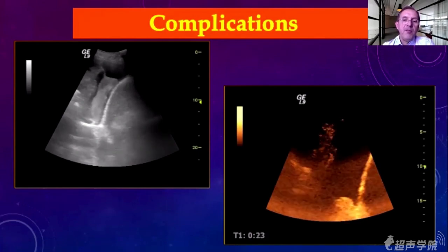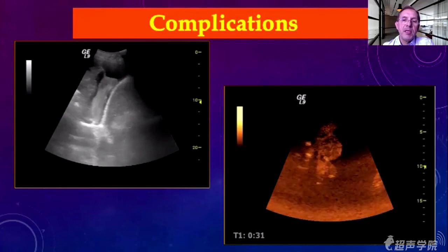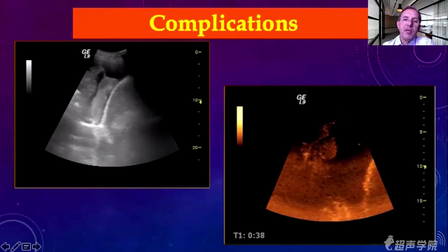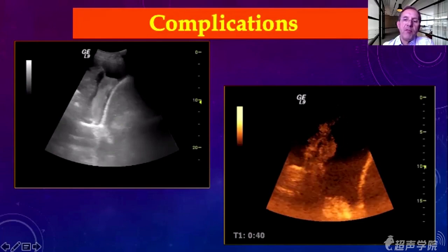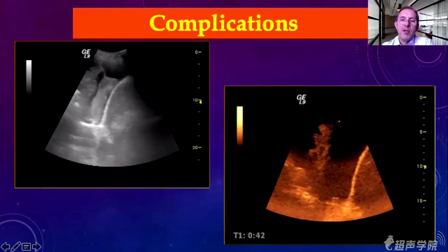And in fact, we saw that there is actually no bleeding inside. The bleeding has stopped. You see very few bubbles here, probably some drops of blood, but it was not an important bleeding, and this was stopped later.